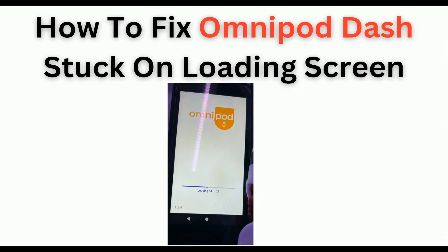Welcome back to our YouTube channel. In today's video, I'm going to show you how to fix the Omnipod Dash stuck on the loading screen. If you are encountering this frustrating issue, worry not — you are not alone. Many users are facing this issue, so you can follow these simple on-screen instructions to resolve it.